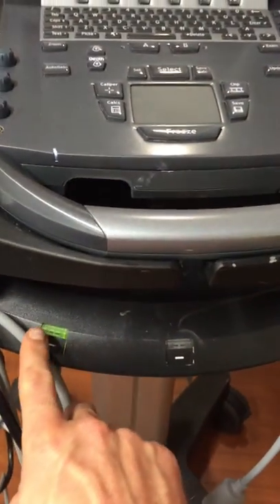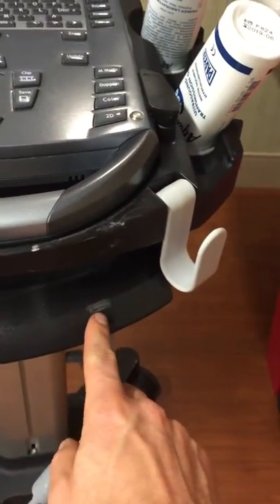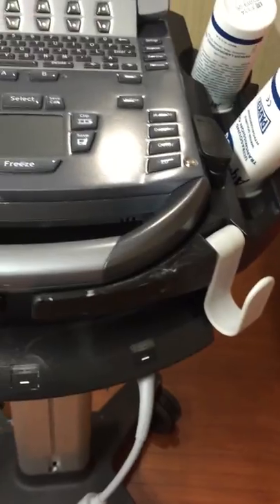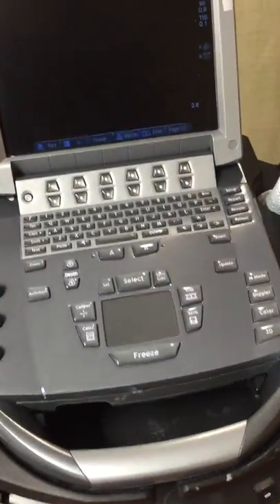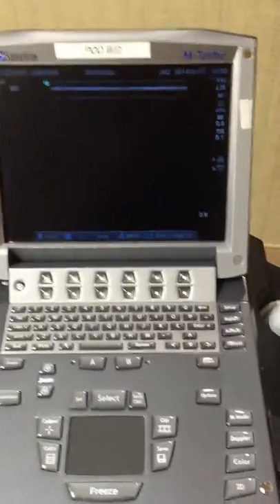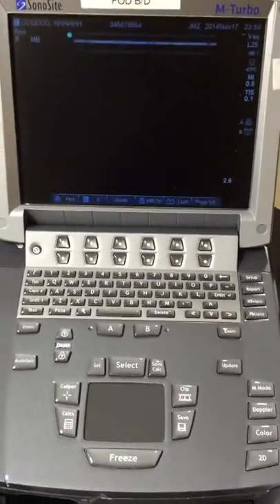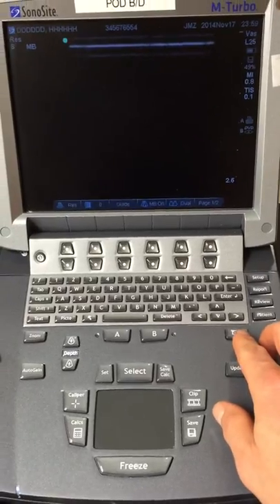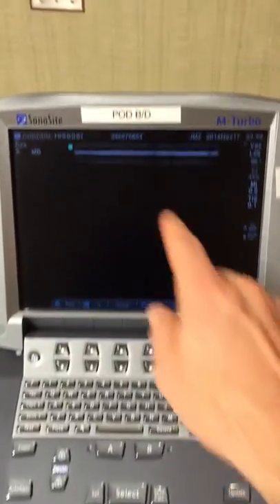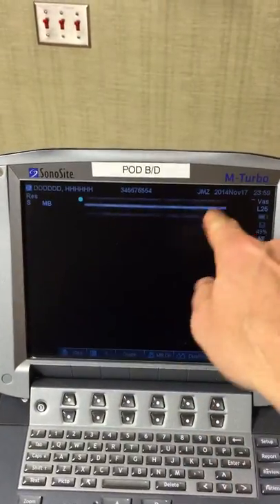Then you go here to click on the probe. You either hit this button or this button, and that just switches it. The nice thing is when you hit the certain probe, there are built-in modalities and settings within each. So here you can tell just by the linear aspect here, we're on the linear probe.